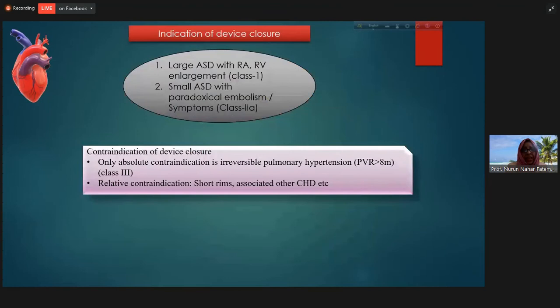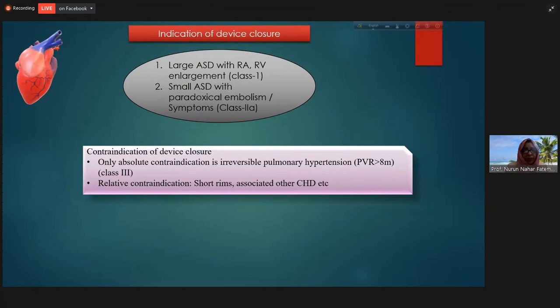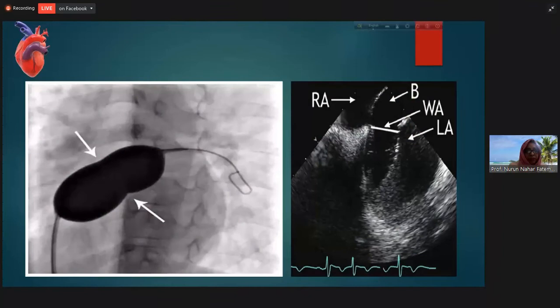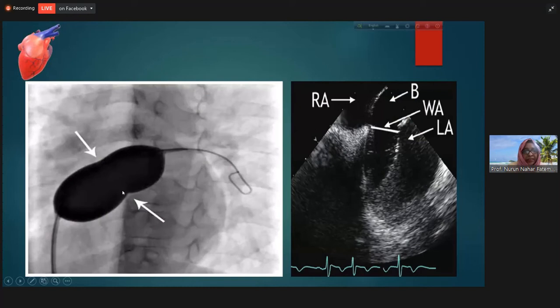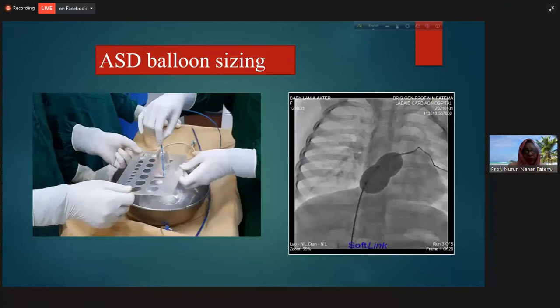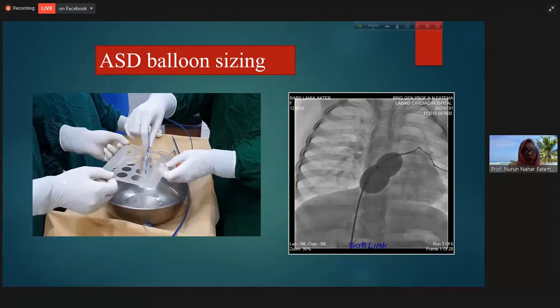These are the hardware used for device closure — clearly visible on TEE and ICE. Indications include large ASD and small ASD with risk of paradoxical embolism. We perform balloon sizing in all cases because it allows selection of the minimum device size possible. When a waist appears in the balloon, we select the device size equal to that balloon waist. With echocardiography, we see the stop flow: when we inflate the balloon and stop flow is confirmed by color Doppler, we stop inflation.